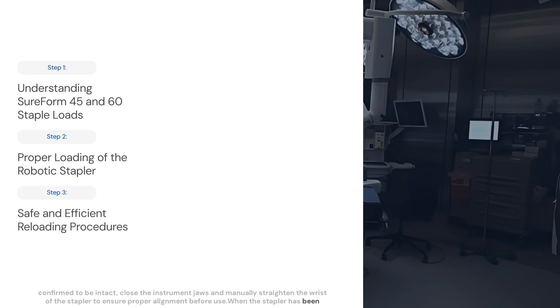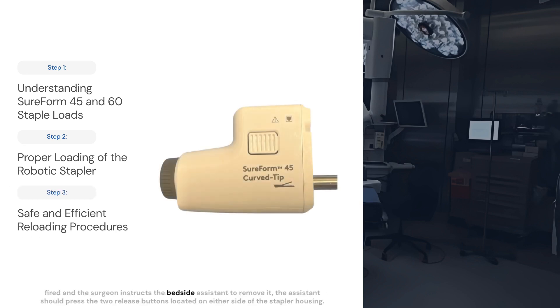When the stapler has been fired and the surgeon instructs the bedside assistant to remove it, the assistant should press the two release buttons located on either side of the stapler housing. This will disengage the stapler, allowing it to be gently withdrawn from the robotic cannula.